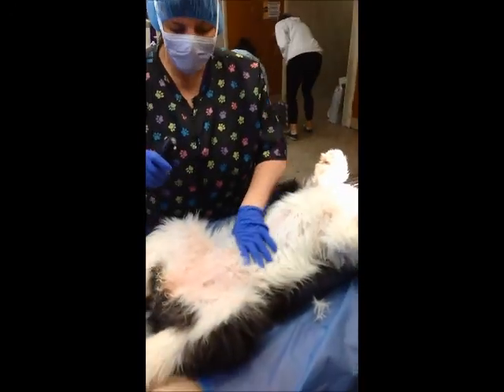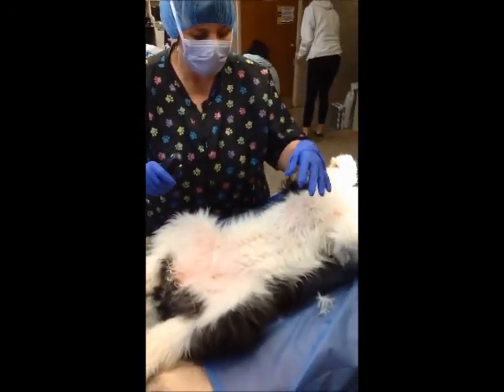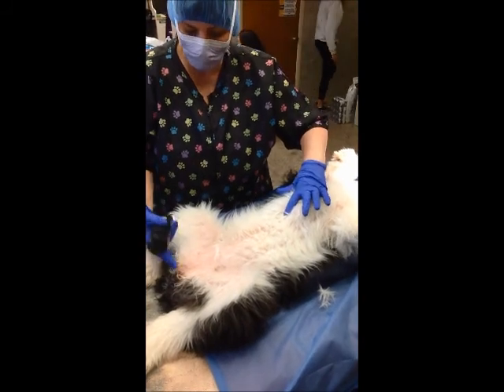All right, we're going to clip Luna up for her spay. She's going to get clipped from the xiphoid process down to her pubis.